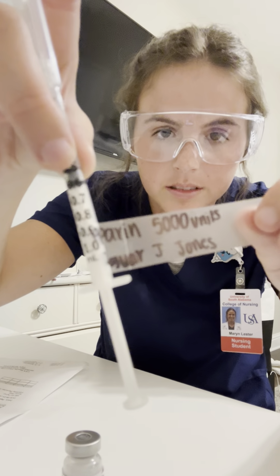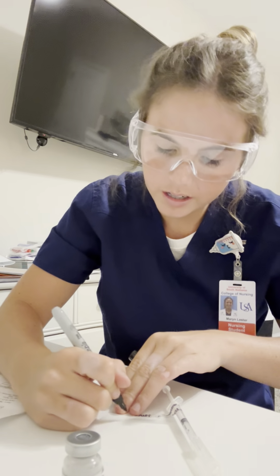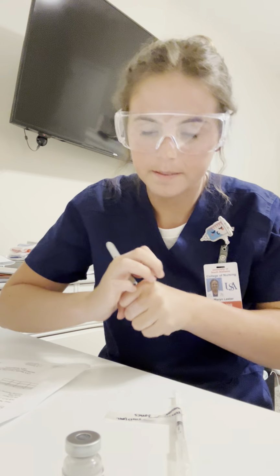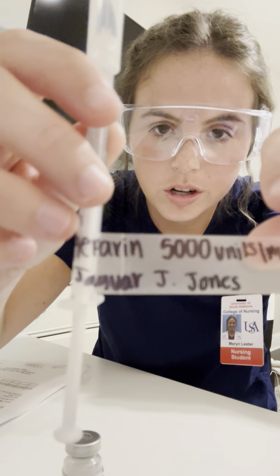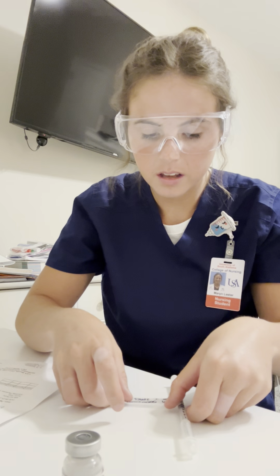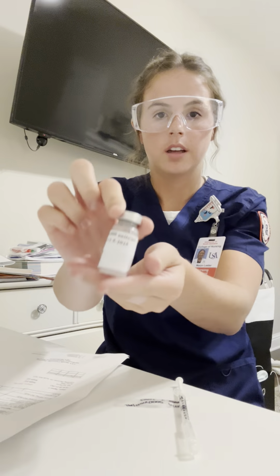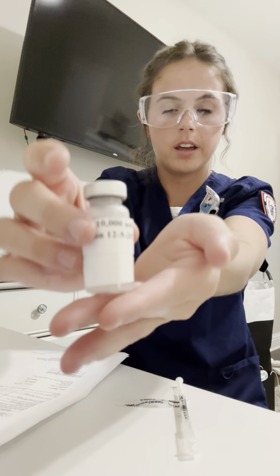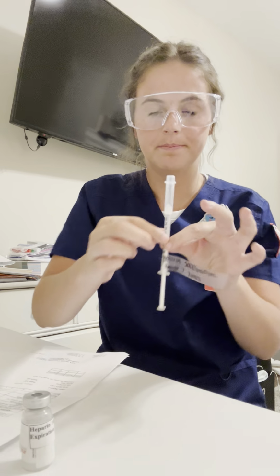This is heparin 5,000 units, and it also needs to say per milliliter. Okay, and then it says Jaguar J. Jones. Perfect. Okay, so now I'm going to go into the patient's room. I'm going to take the MAR form with me, the heparin vial with me, along with the injection.